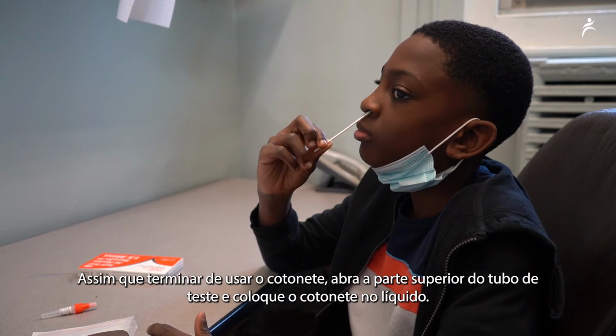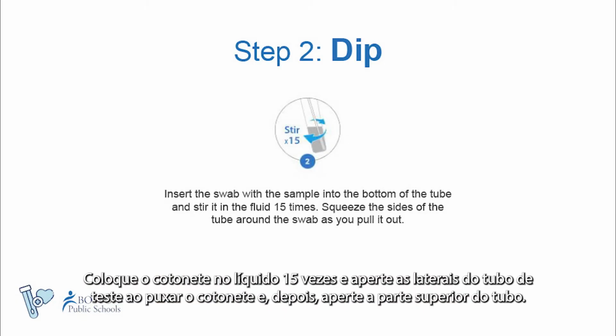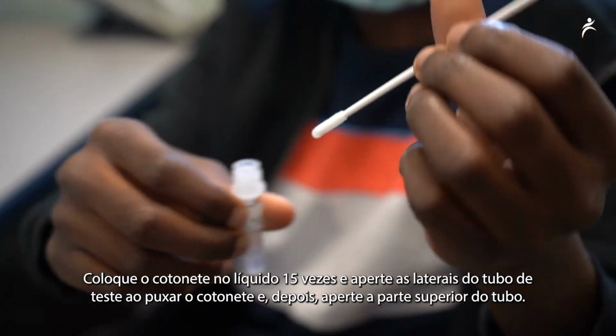Once you are done swabbing, open the top of the test tube and place the swab into the fluid. Stir the swab in the fluid 15 times and squeeze the side of the tube as you pull the swab out. Then tighten the top of the test tube.